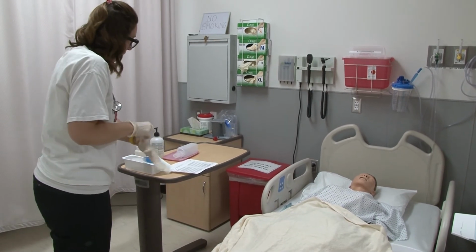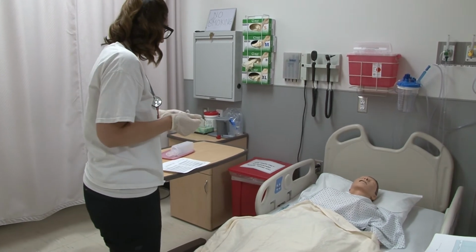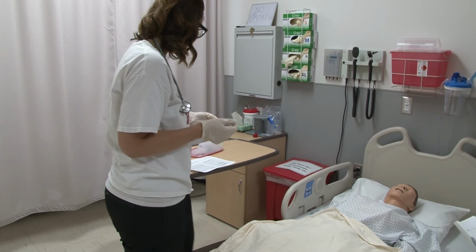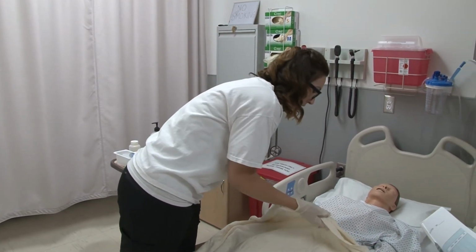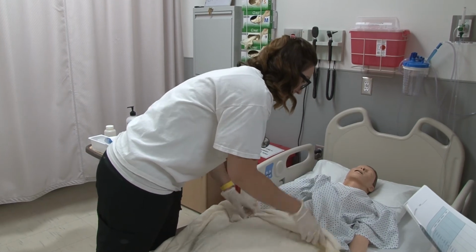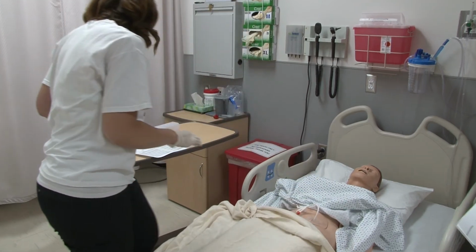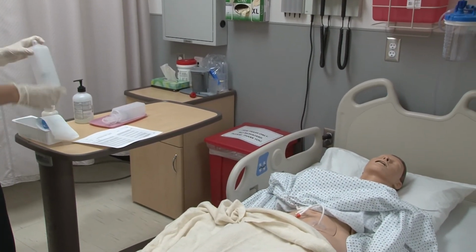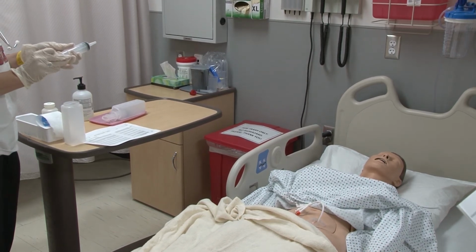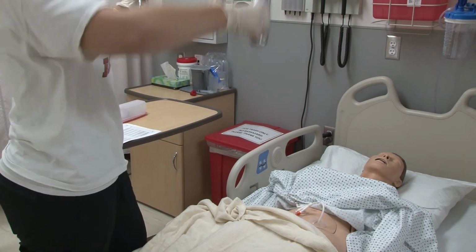Okay, Mr. Rogers, I'm going to be administering 2 medications to you through your Gtube this morning. One is Cardi, and it's 60 milligrams, and the other one is Pred, and it's 10 milligrams. So I'm going to go ahead and pull your blankets down just to expose your stomach a little bit so I can get to your Gtube. Okay. And I'm going to grab my other piston syringe that's empty here at the patient's bedside, and I'm going to pull up about 20 mLs of air, because I'm going to check placement before I administer your medications.